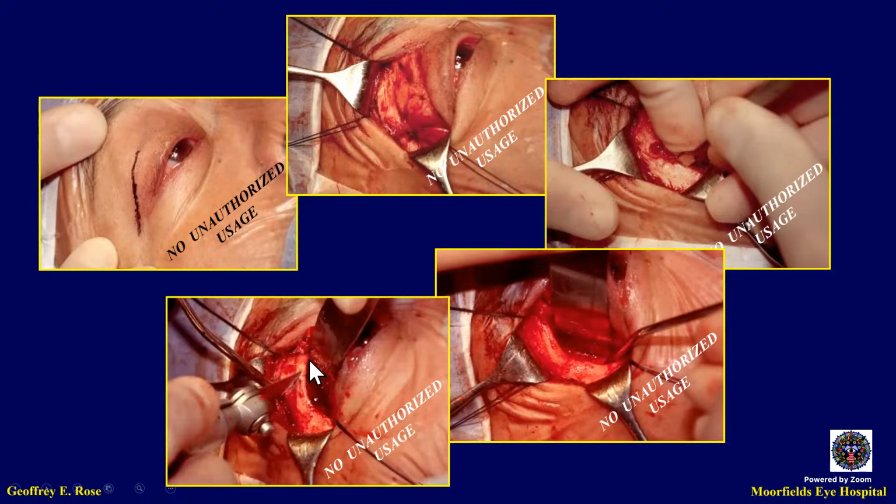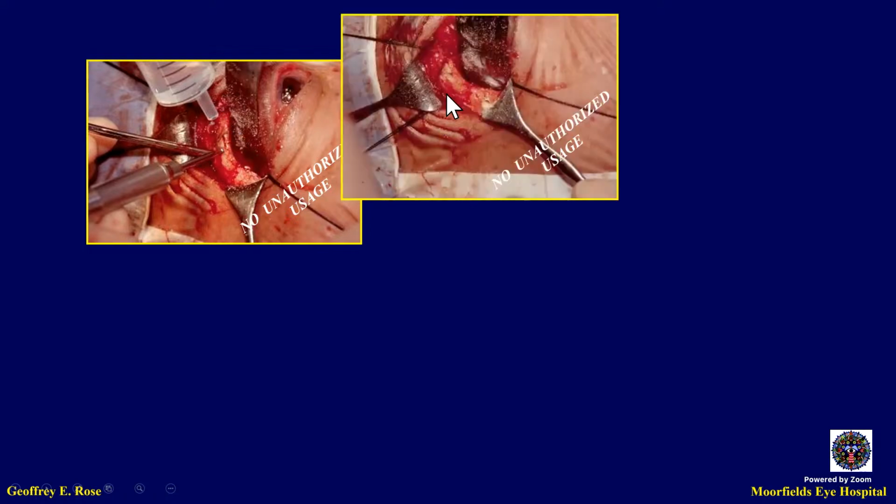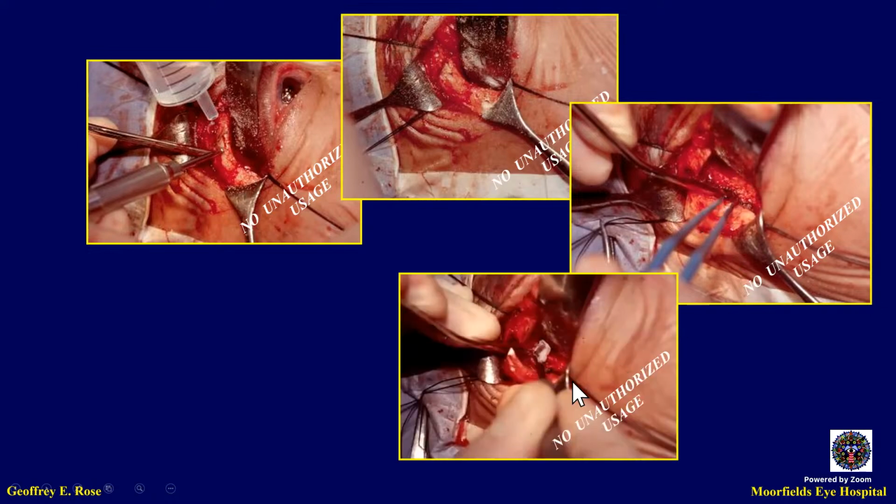And then we do the incisions, parallel incisions at the top and the bottom, to give you a nice broad piece of bone mobilization. And then we drill a couple of holes either side of the saw cuts. So you have your holes, and then we break this outwards. And we don't take the bone out now, we just tend to swing it out. You mobilize the temporalis muscle from behind where you've broken it off, trim this bone down, and if necessary, use bone wax. And you really get a very good view of the lateral periosteum.